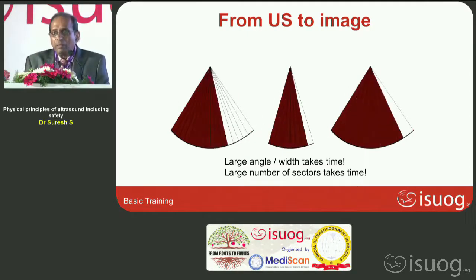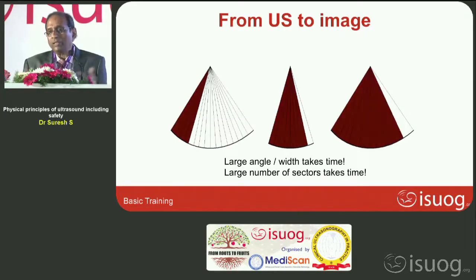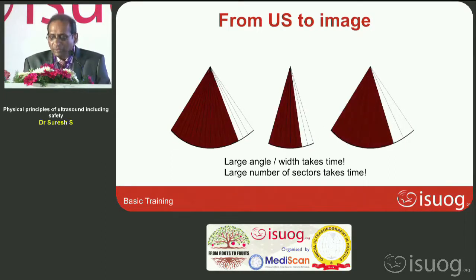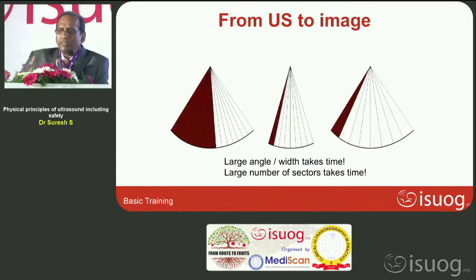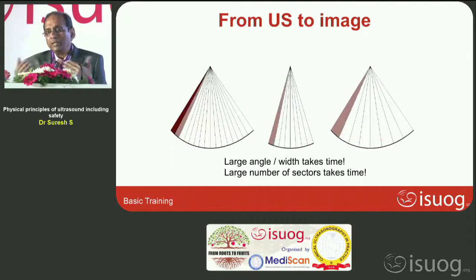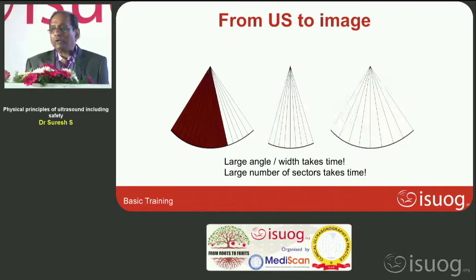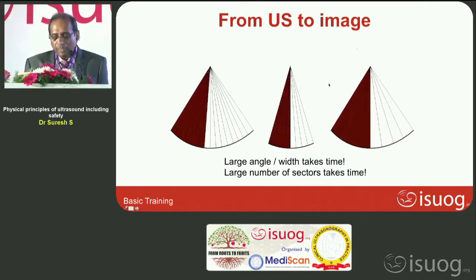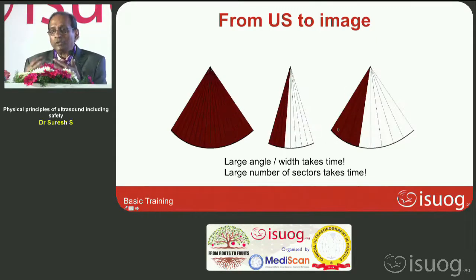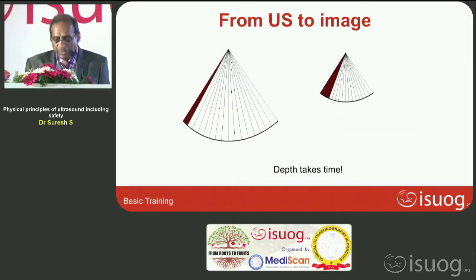It's also important to remember that when you use a sector, there are a number of lines. The more lines you use to produce the image, the longer it takes. When the lines are very large in number and very close to each other, it will produce a very good image, but it will take a long time, and the overall frame rate will come down. That's why, when people do echocardiography, the machine automatically brings in a smaller sector, so that the frame rate can keep up with the fast heart rate.